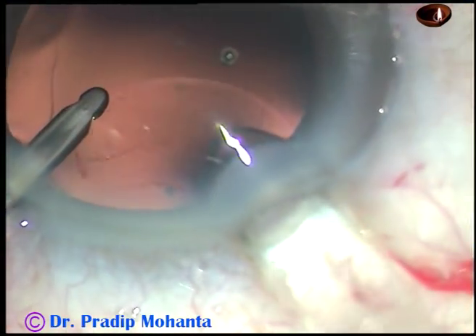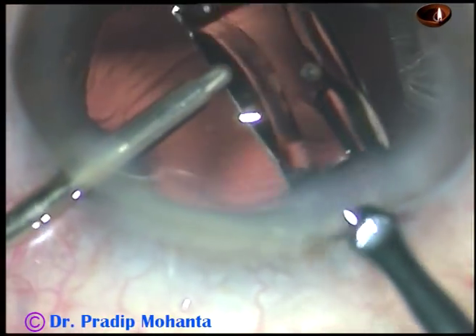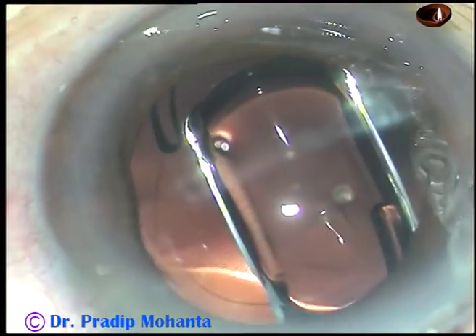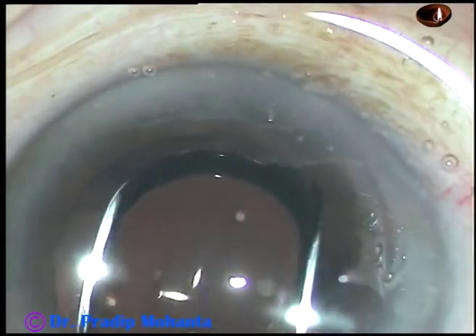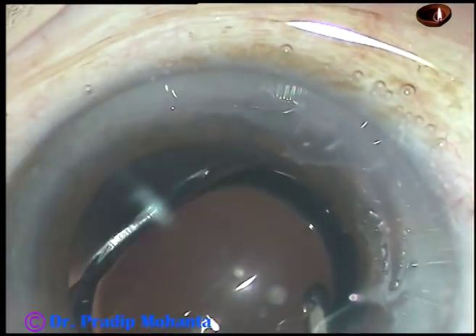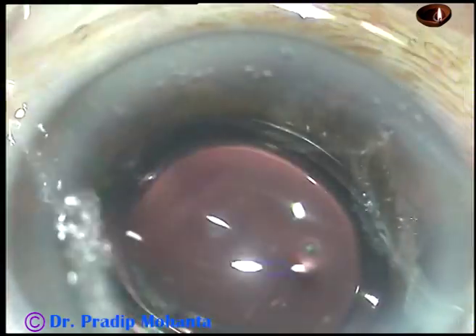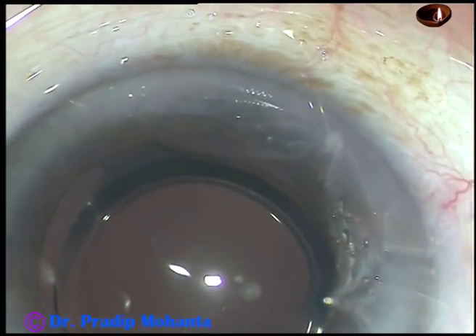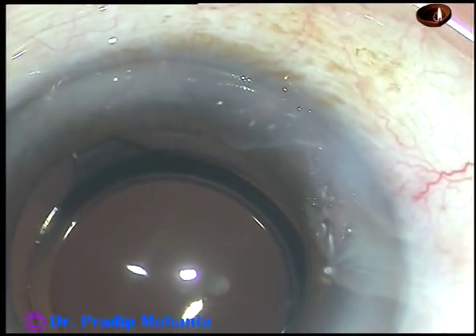And here goes the foldable intraocular lens — this is a hydrophobic intraocular lens — going into the capsular bag. And now I dial the lens with the irrigating probe itself. The lens is moving a lot because the haptics have not yet opened up. The haptics will open up, take shelter at the equatorial part of the capsular bag, and then the lens will be stable.